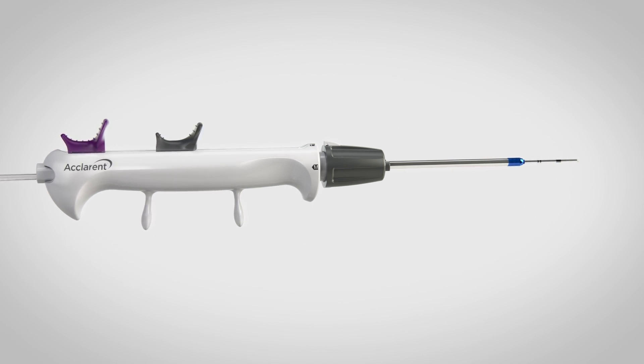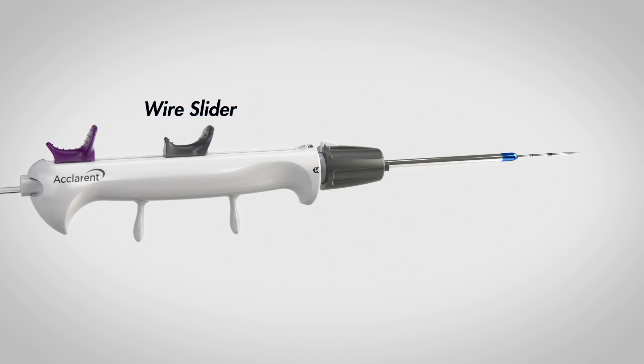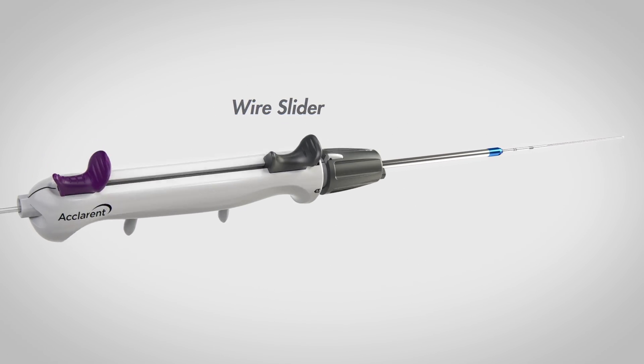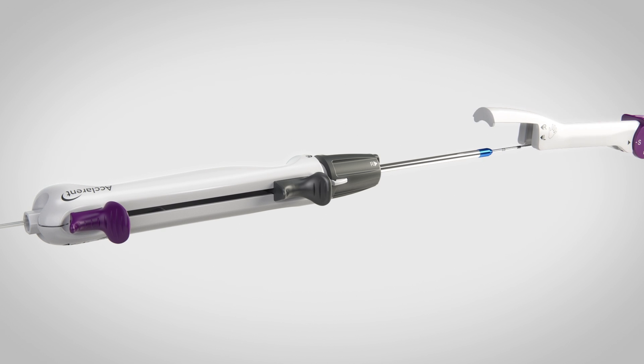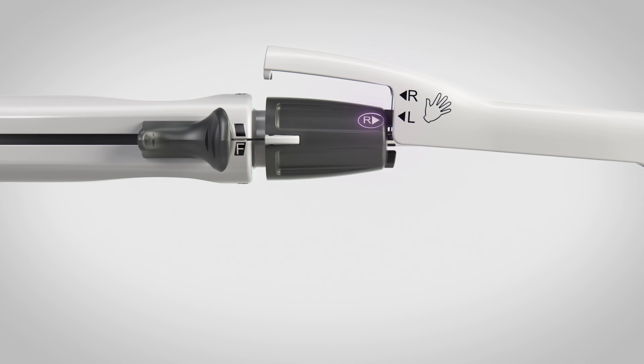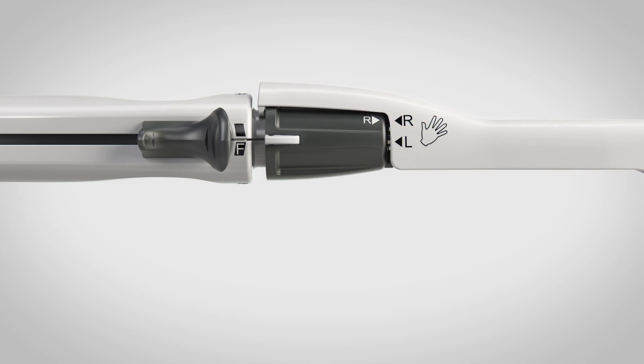To prepare the device for frontal or maxillary sinuses, advance the gray wire slider until it stops near the gray collar. Guide the angle selection tool over the device. Line up the white R on the gray collar with the black R on the angle selection tool. When correctly aligned, the angle selection tool will fit closely around the gray collar.